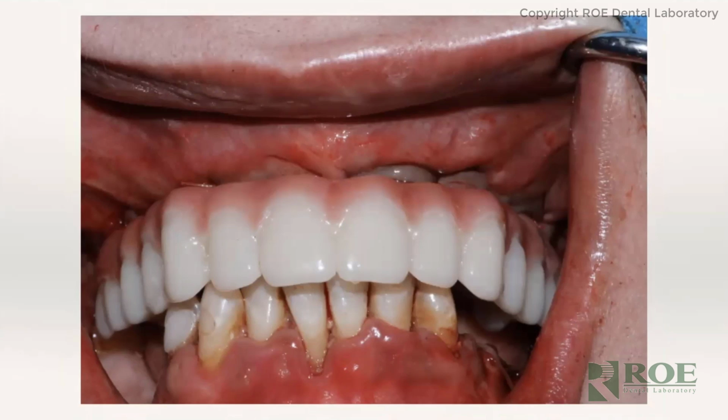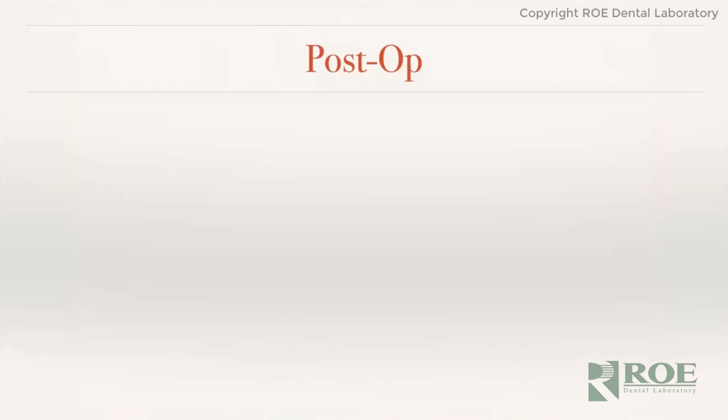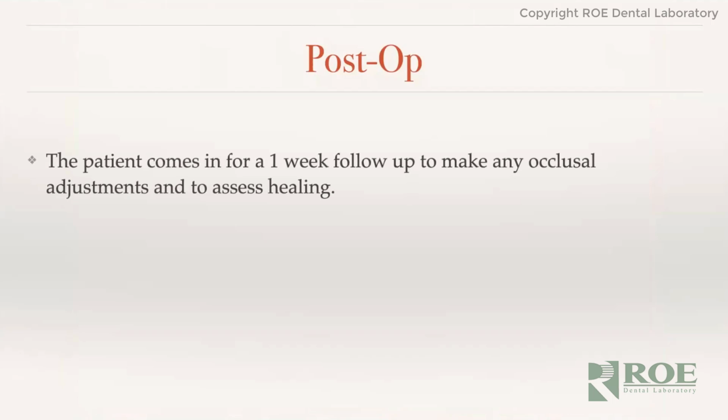We actually nasally intubate, so we're never able to get a true occlusion. We always bring the patient back to do an occlusal check within 1 week. Obviously, they're on a liquid diet at that point in time. So our post-op workflow is this. The patient comes in for a 1-week follow-up to make any occlusal adjustments and to assess healing.